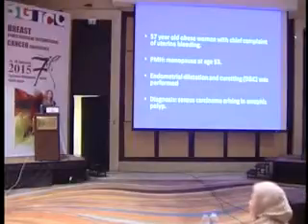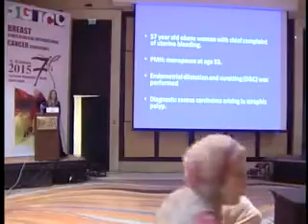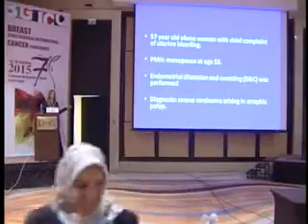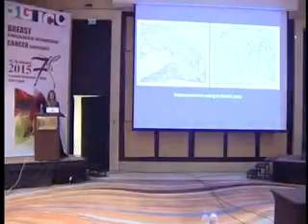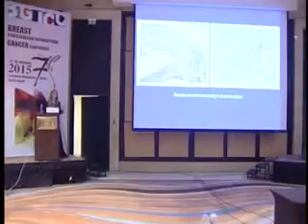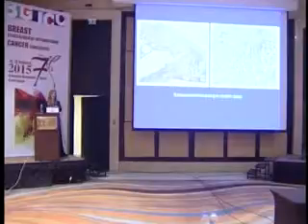The last one. This patient was diagnosed by D&C as endometrial adenocarcinoma. The patient went through hysterectomy. In the hysterectomy, frozen section diagnosis, there was no tumor. That was her D&C, it was like an atrophic polyp. In the polyp, we got serous carcinoma. In the hysterectomy specimen, there was no polyp, no mass, no carcinoma. So what would you do? You submit the entire endometrial cavity, entirely.